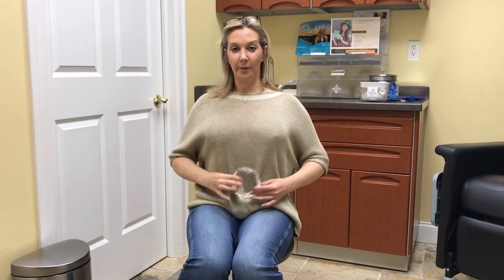You have 4 places you could put incisions. I'll say right off the bat, one of them is really dumb, and nobody should ever do it that way, and it's through the belly button. There's a procedure called the TUBA, or the transumbilical breast augmentation. It's really dumb. First of all, you have to use the saline implant because you can't shove this all the way up from the belly button to the breast. But second of all, you are taking an incision down here and doing a remote dissection, and getting the pocket correct is difficult, and I've seen more problems with it than I care to mention, and I don't do that procedure. I don't think it's a good idea. I've seen nice results in other people, but it's not for me.